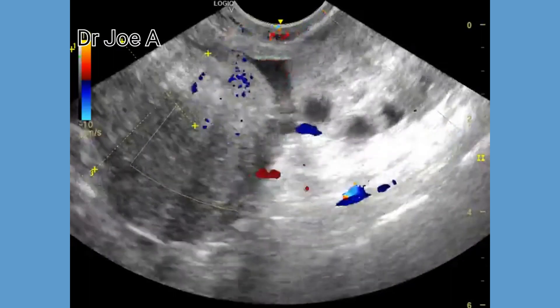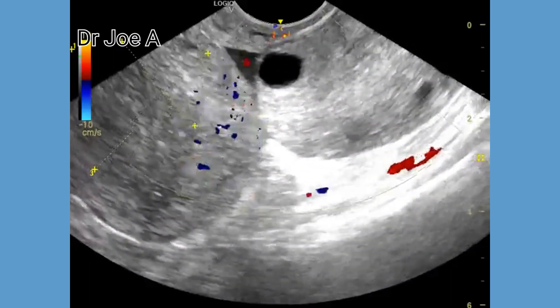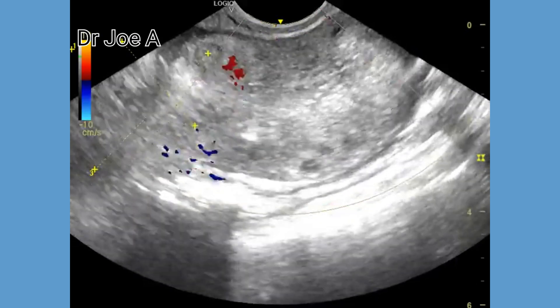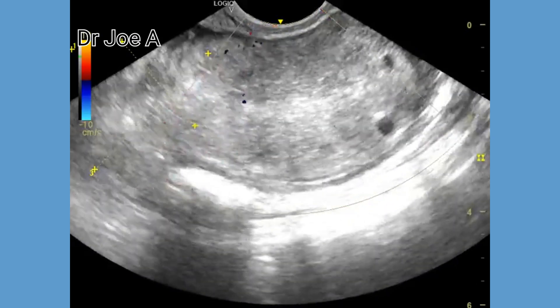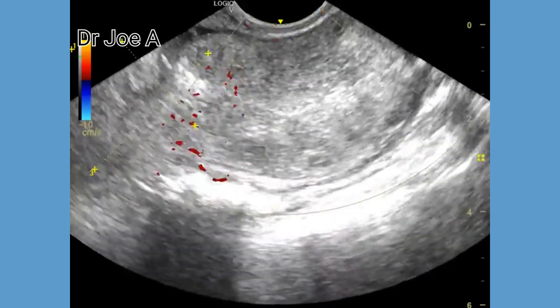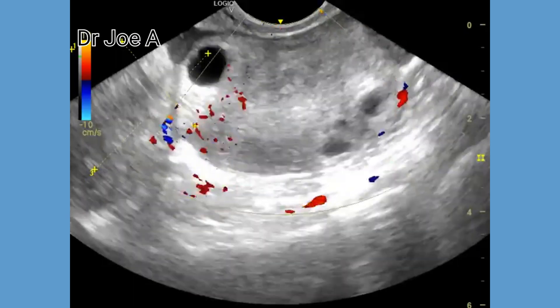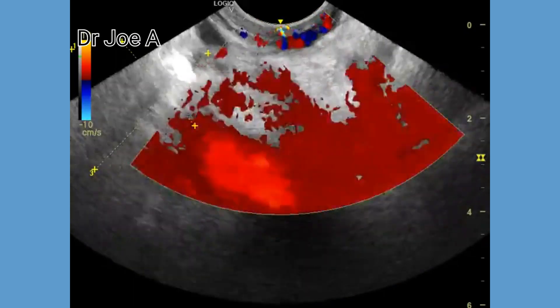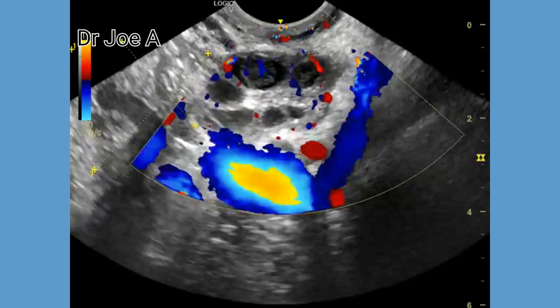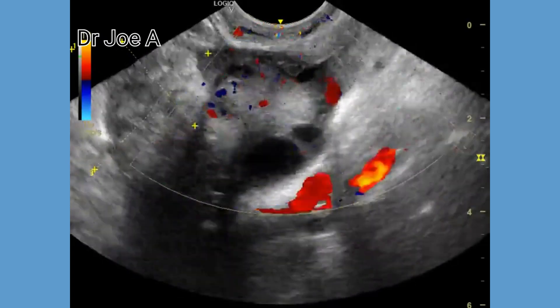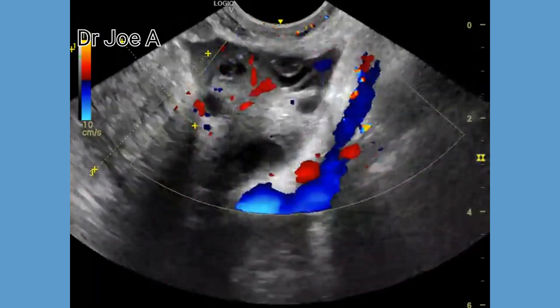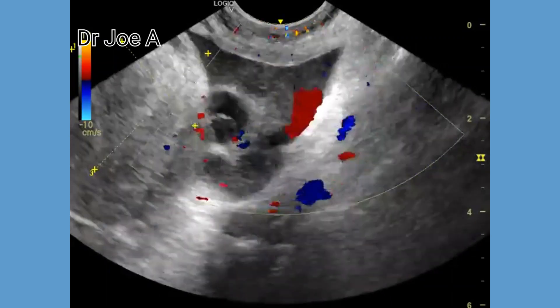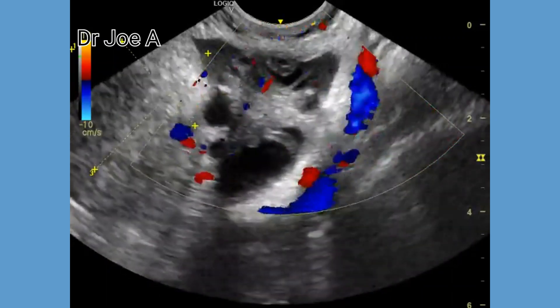However, both ovaries show evidence of PCOD, or polycystic ovary disease. On comparing both ovaries, the right ovary is far larger in volume than the left ovary. Surgery confirmed our diagnosis of torsion of the right ovary. The final diagnosis is torsion of the right ovary with bilateral polycystic ovarian disease.